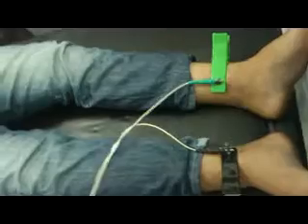No. Triangle is for the bipolar leads, remember. Triangle is the bipolar leads. I'm asking about the unipolar chest leads, okay? One by one. V1. Between the fourth intercostal right. Fourth intercostal space, not cartilage. Space, in V1. Two and the left.